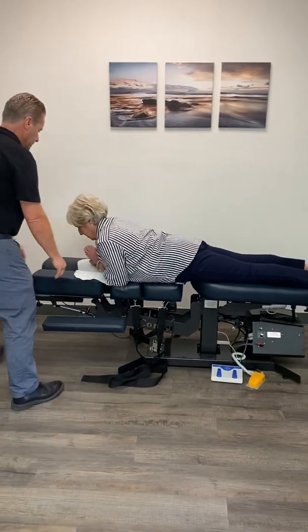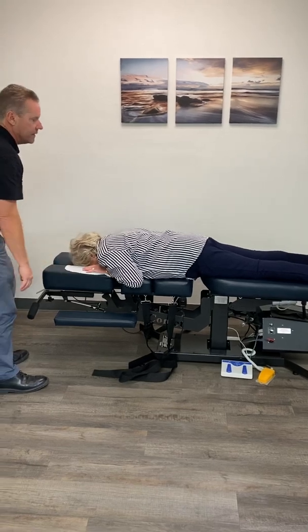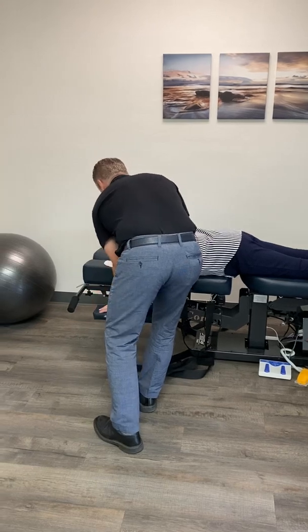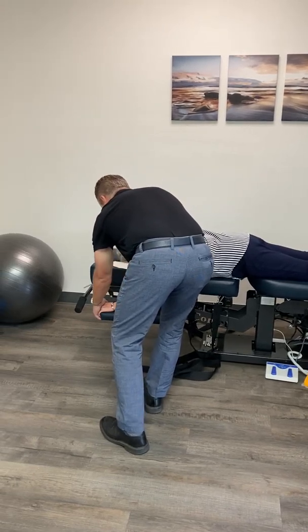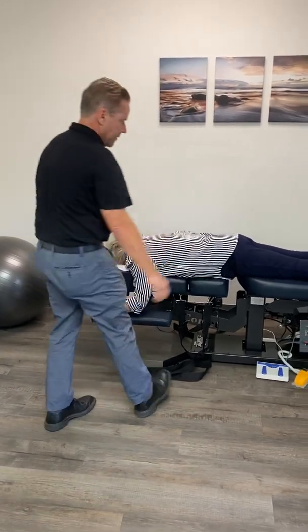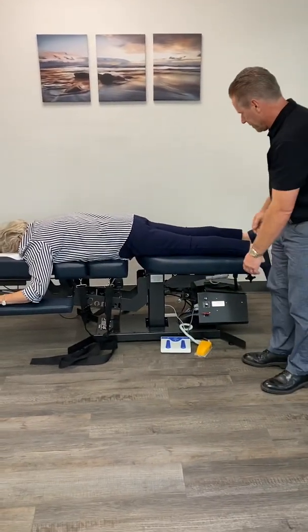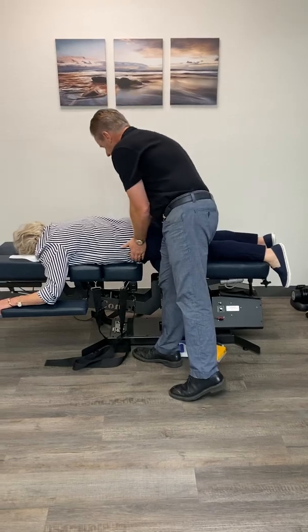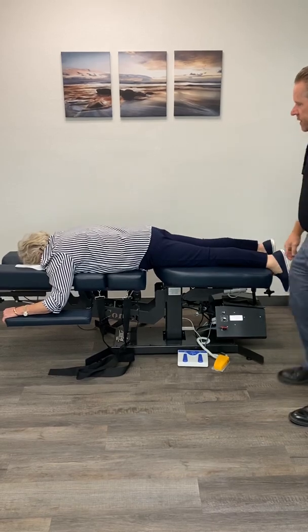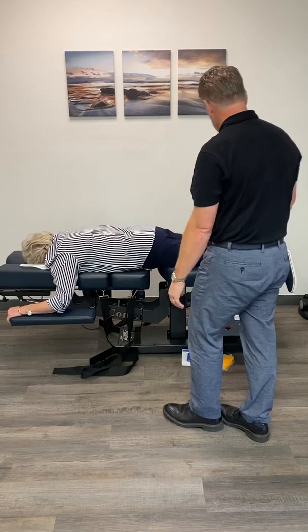Okay, so your ankles are hanging off, and then you can just rest your head down there. And then eventually this thing's going to be moving, so you can have your arms down here like that. You can hold on right there. Some people hold on way up here, but I think that's probably too much of a reach for you, okay? And then from there, we're gonna try to get you kind of squared up on this a bit. So I'm just gonna slide your hips over just a bit. And since we're gonna be doing range of motion, we wanna start from some mild extension, and this is gonna probably even be more comfortable anyway.